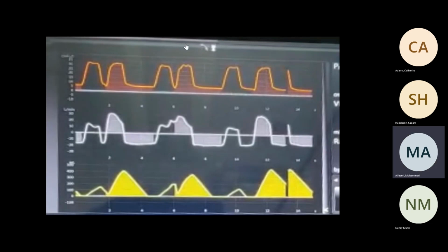That's the only difference between the two, but the other two look similar. That's an early trigger by the patient basically. So this one should be like this, is that right? Straight line, and like this. And then I have another breath, like this, and then like this. Is that right? But in here, I have a little bit of a notch, and then I have a whole breath extra in here, is that right?